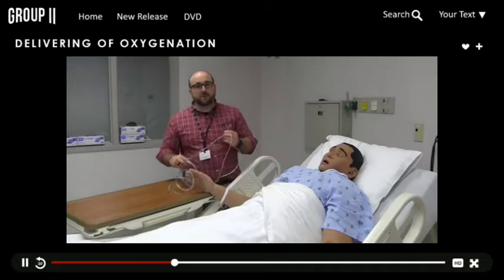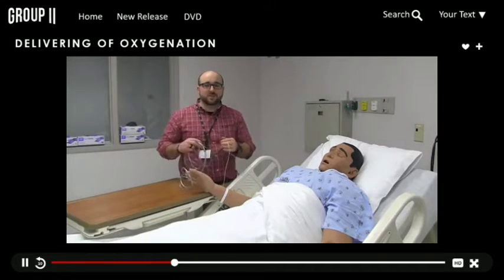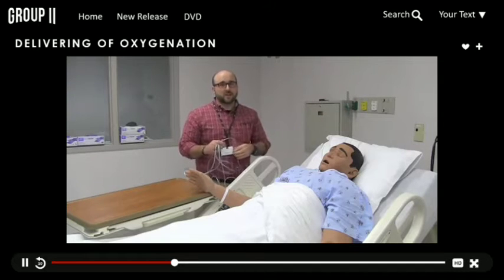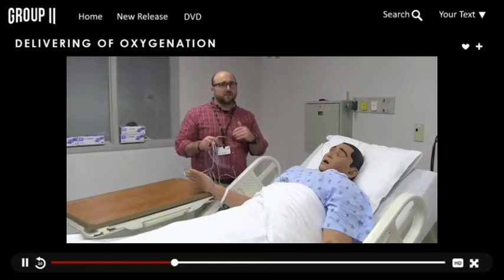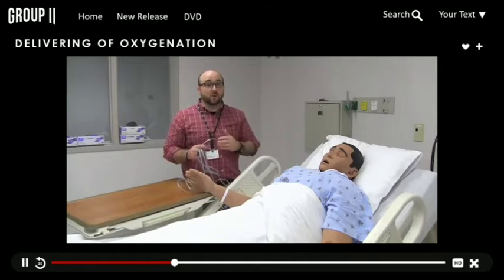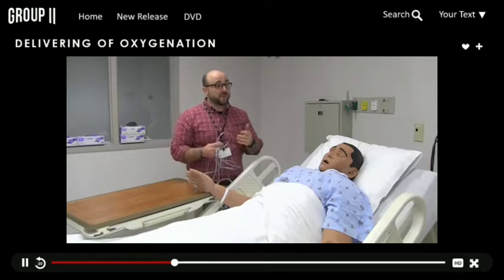Alright, so we'll start with the first low flow oxygen device, which is the nasal cannula. A standard nasal cannula can deliver 1 to 6 liters of oxygen. And we'll talk about that shortly, what that converts to in the amount of oxygen they're actually inspiring, or their fraction of inspired oxygen, or FiO2.